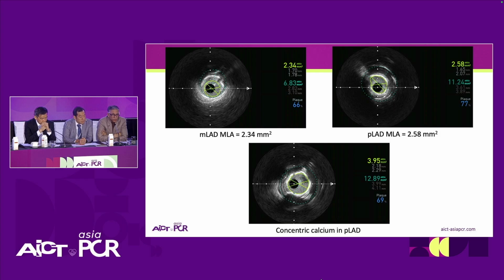I think the only issue will be that the lumen, as Jason pointed out, is pretty big. So if you go even with a 1.75 burr, which I absolutely agree with Mark is a good starting point, you may not get as much ablation as you would like. Then your next option will be to either upsize the burr, or think about using orbital, or go with device combination or synergy, which means you do some rotablation and then you do something else after that, cutting balloon or IVL or something. So that's how I would think about it. Okay, so in this case, you're okay with starting with a 1.75? I think so, yeah, I agree.